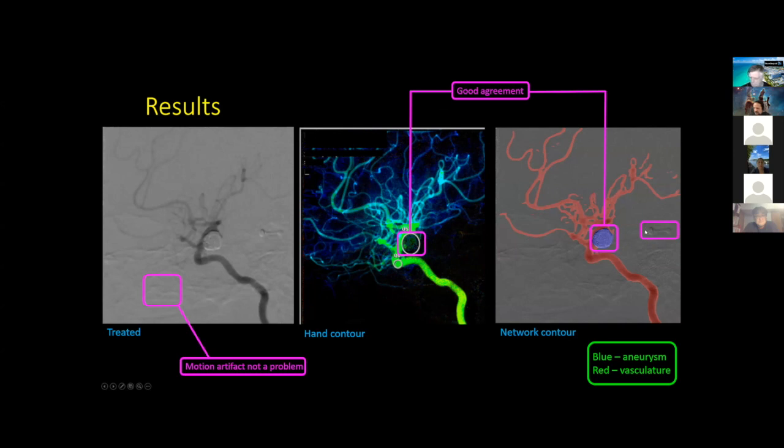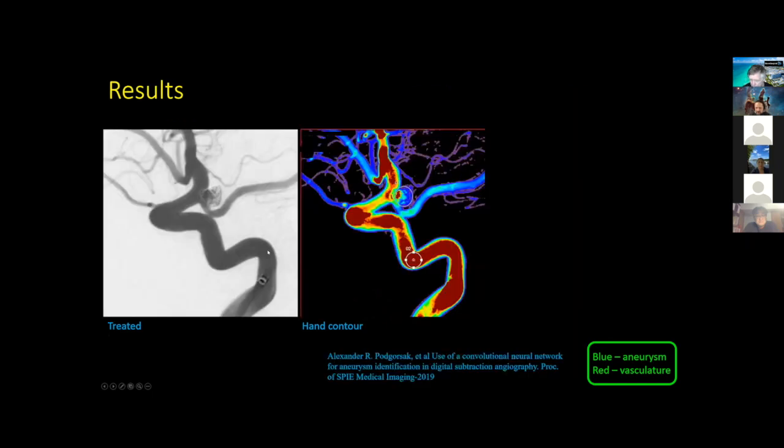In this case, this patient had an intracranial hemorrhage and he had a craniotomy, as you see in here, and a shunt placed. Again, no problem when you have hardware like this in here. Highly attenuated structure is not throwing it off because it has been trained only to look at this kind of data and can easily ignore those.